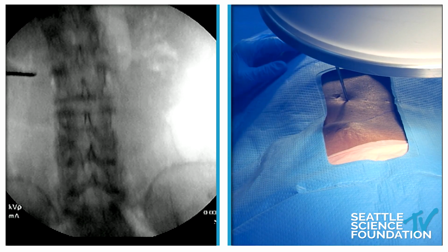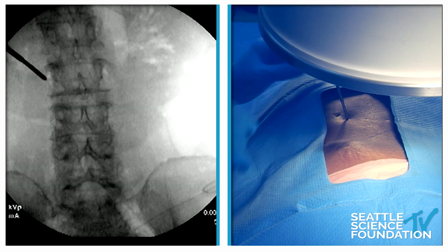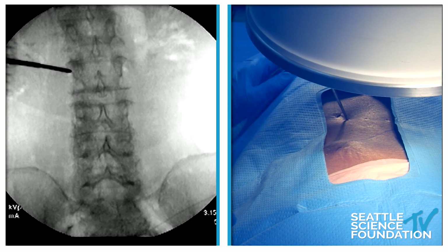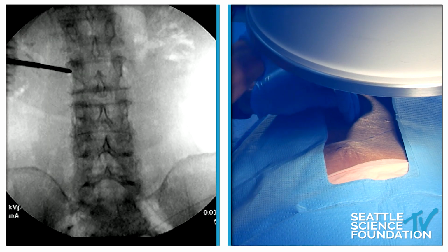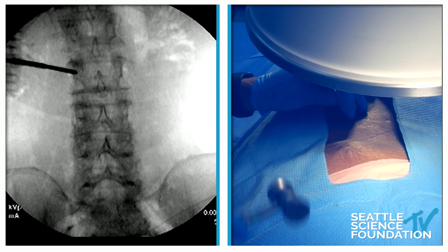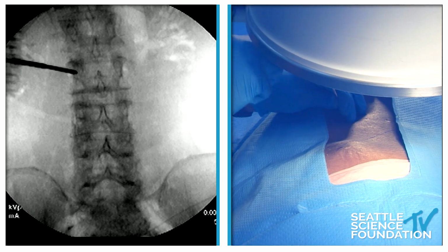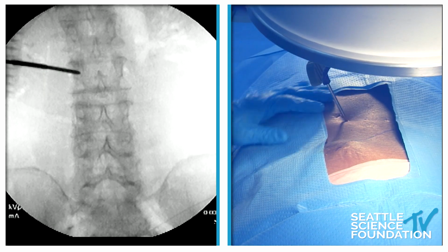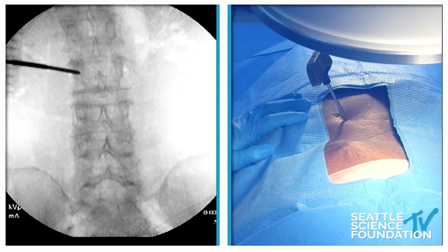And Doug, you're often doing these on an ambulatory basis, so you're using a spinal needle to establish the anesthetic tract before entering, all the way down to the periosteum, and that's part of the real key about doing this. If you numb all the way down, you can really do justice to the patient.